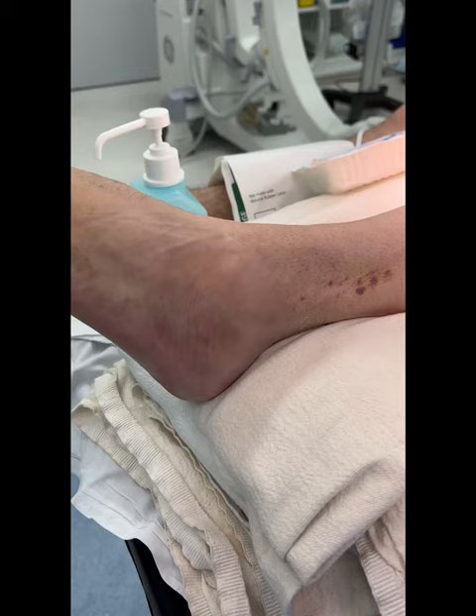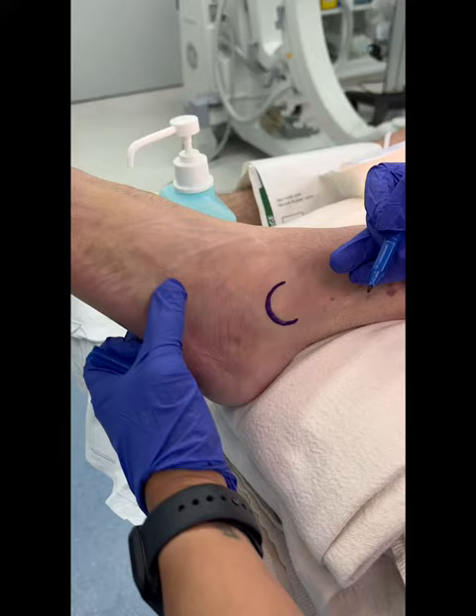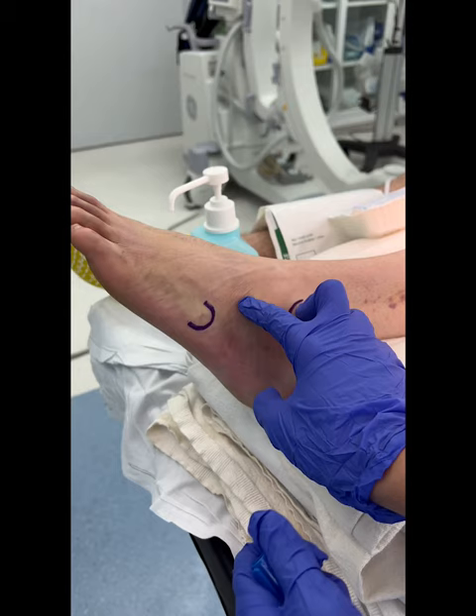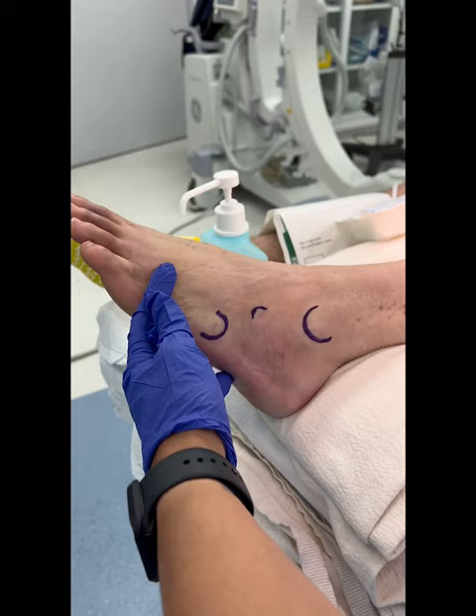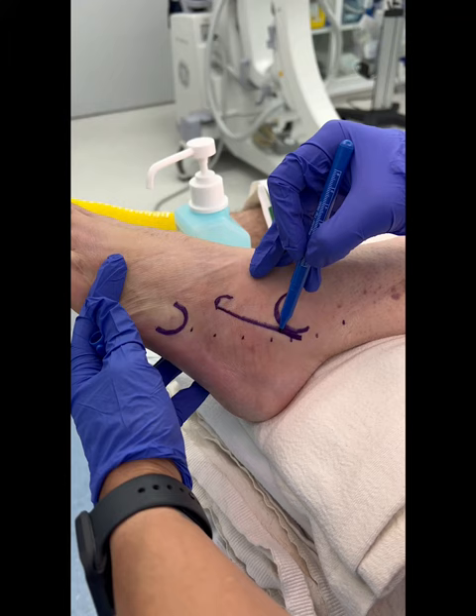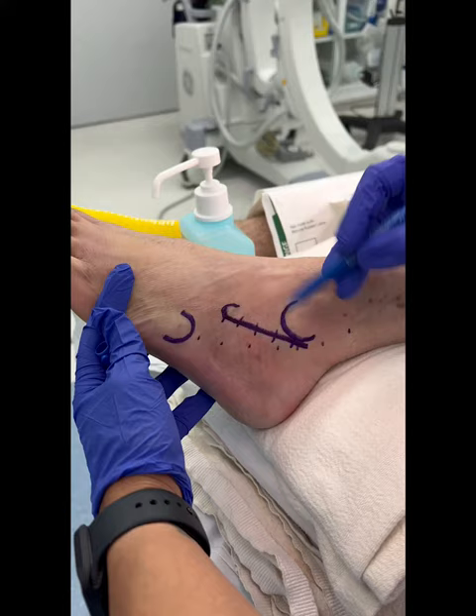I mark out my fibula and I mark out my fifth metatarsal base here. I usually take these two fingers, and right where my index finger is the anterior process of the calcaneus — that's about right here. So I know my incision is going to come right in front here, pulling back to the peroneal tendons, just under the fibula, going towards the anterior process of the calcaneus. That'll give me access to my joint line.